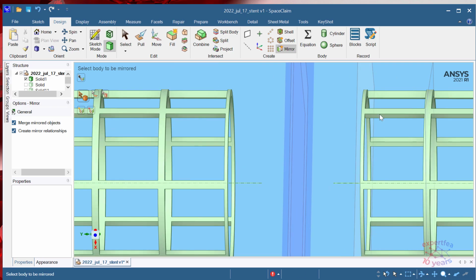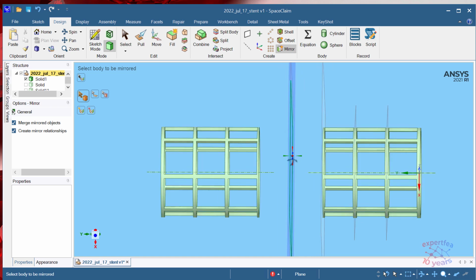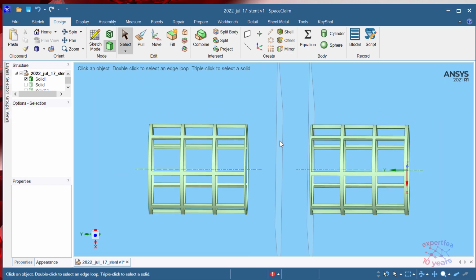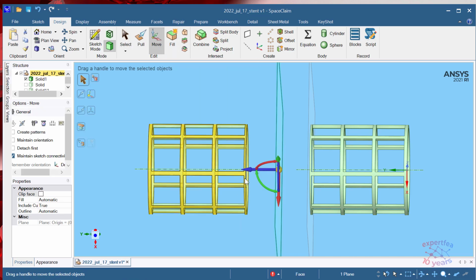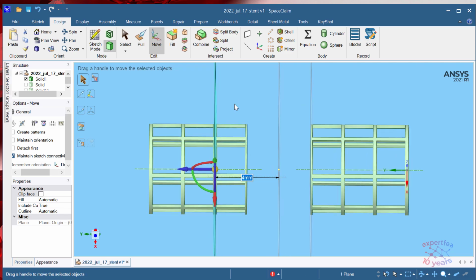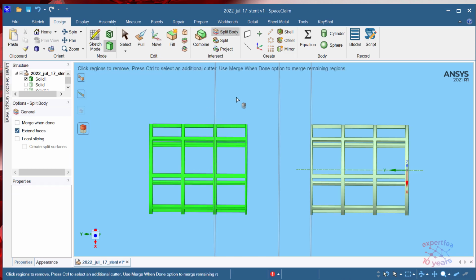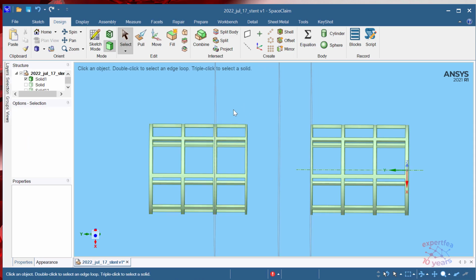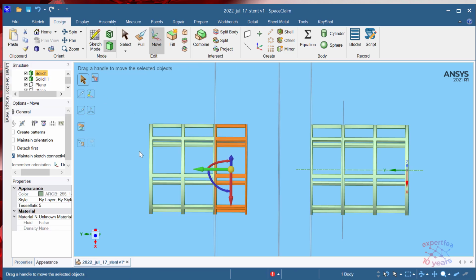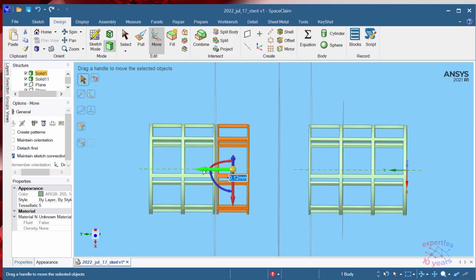In here we need to insert this, not this, but two of these. Yeah, let's see. So I will copy again this to 4 mm. For fun, let's split this body with this plane. I have this thing which I like very much. Then you know what? Let's just copy paste. Move this object, the last one, this one. I'll move it in this direction.